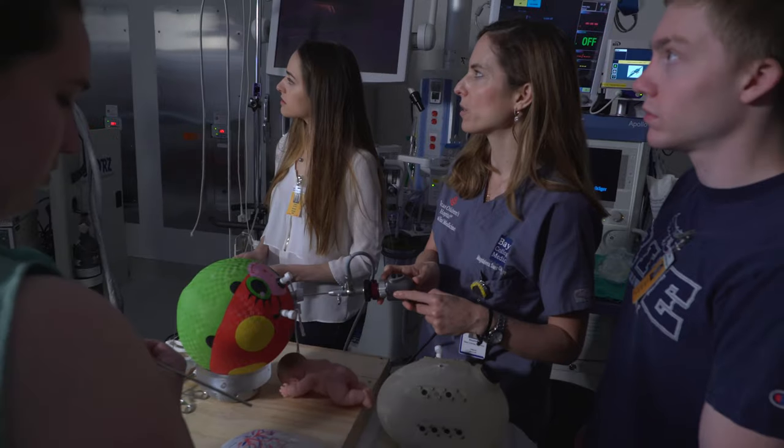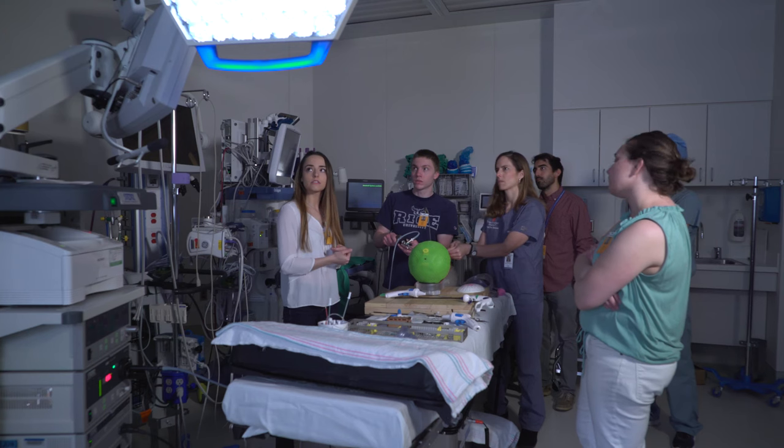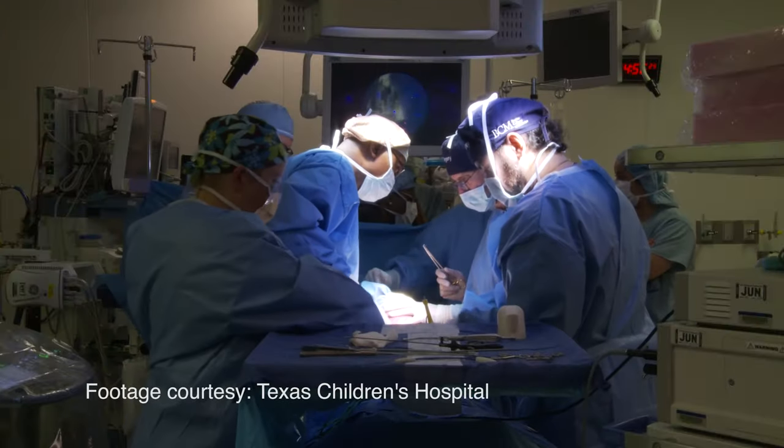This is something similar to what we see in the OR. The objective of this project was to develop a device to be able to monitor fetuses during fetal surgery.